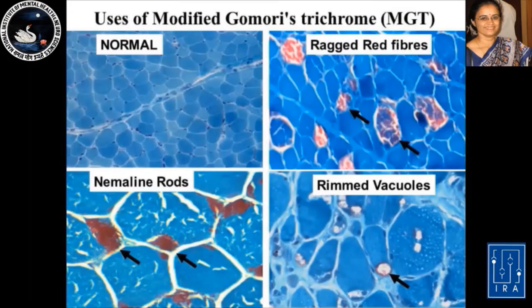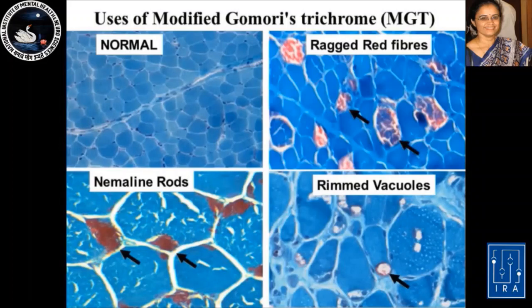This slide shows a muscle biopsy stained with the modified Gomory trichrome stain. This is most useful to identify three specific features: ragged red fibers seen in the top panel, which are very characteristic of mitochondrial myopathies; nemaline rods seen in the lower panel as red needle-shaped inclusions like a cap below the sarcolemma of each myofiber; and rimmed vacuoles wherein each vacuole is outlined by red granular material, a frequent feature seen in inclusion body myositis.